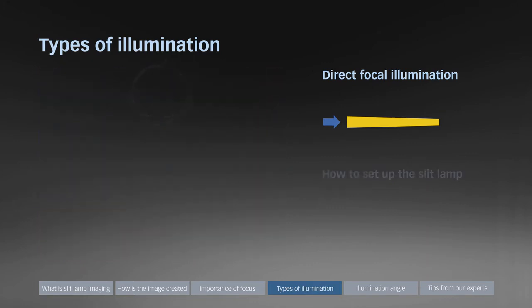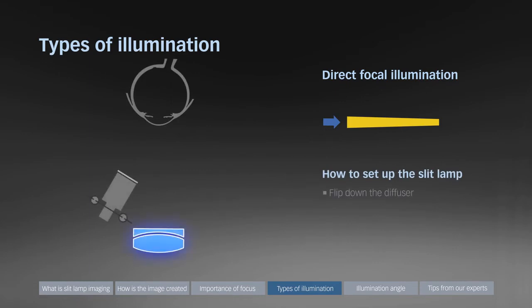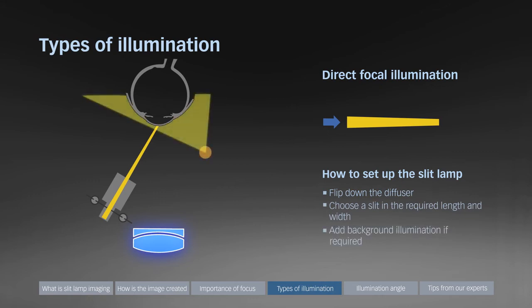To set up the slit lamp for direct focal illumination, flip down the diffuser, choose a slit in the required length and width, and add a small amount of background illumination if required.